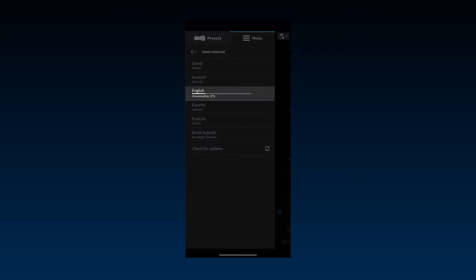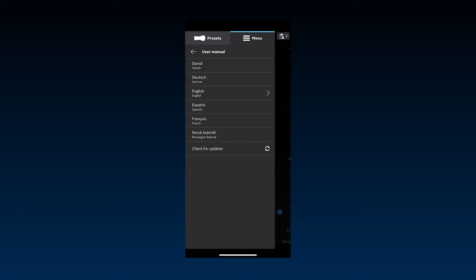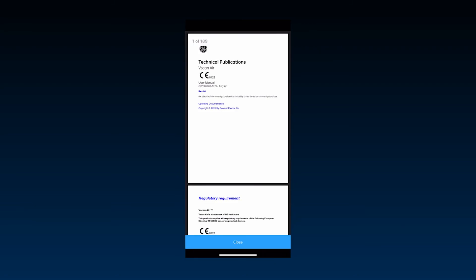When downloading, the display device should be connected to the Internet. Because iOS devices are only capable of handling a single Wi-Fi connection at a time, the probe would have to be temporarily disconnected if a Wi-Fi network is needed for Internet access.